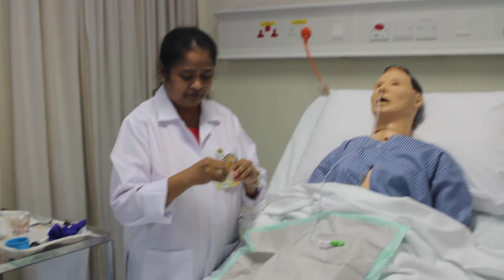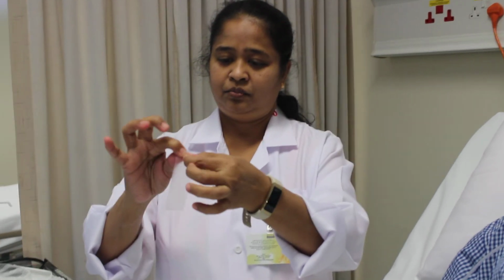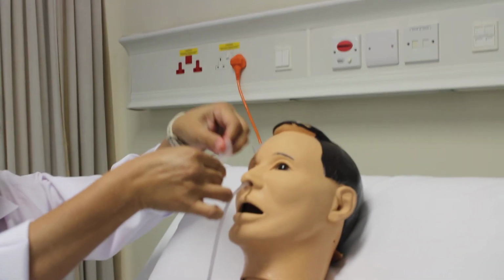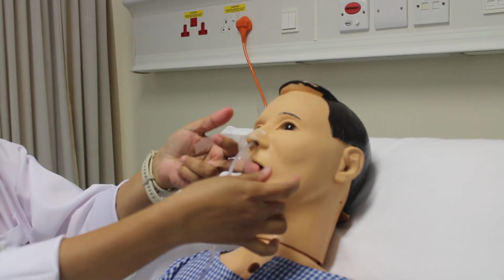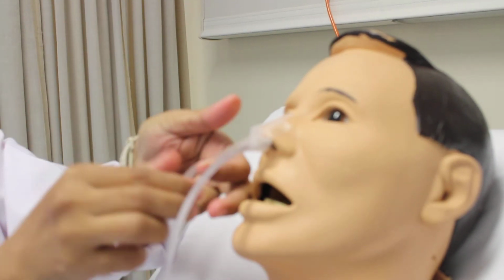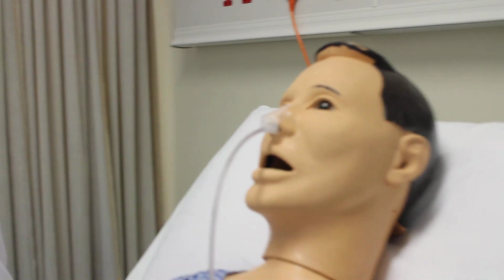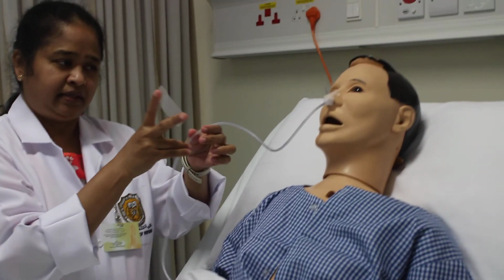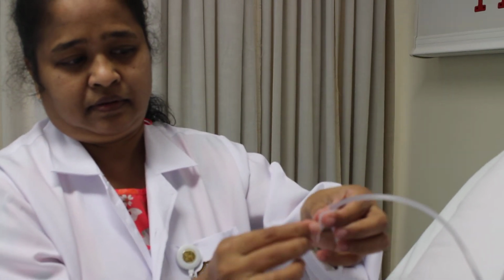There are different ways of fixing it. This is the best way. You take a micropore and divide it into two, but don't divide the upper portion. Fix the upper portion on the nose bridge. There are two tails which we have made. Take one of the tails around the tube and fix it on one side of the nose, and cross the other tail and put it on the other side. And one more strip, you take like this and fix it on the NG tube. Close it.